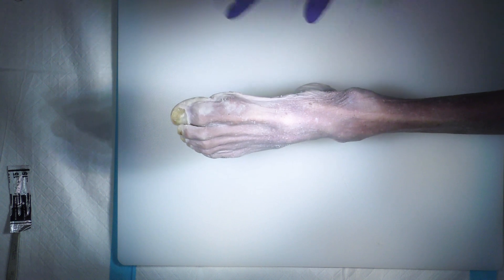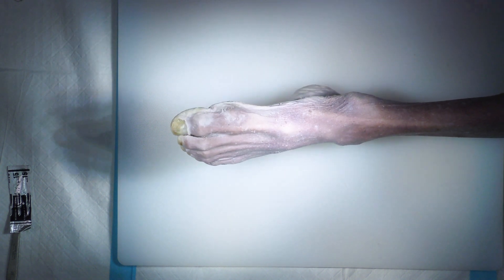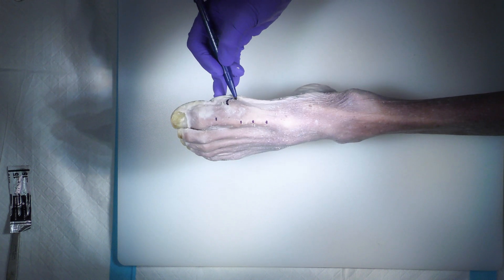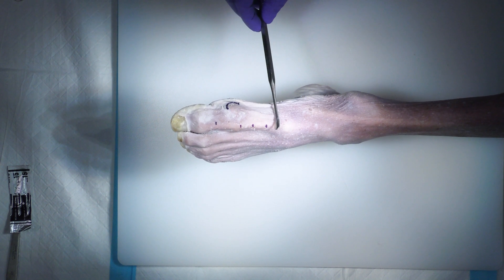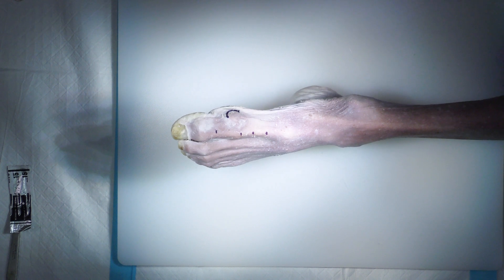First I'd like to be on the medial side of the patient, obviously identifying my landmarks. Here's the EHL tendon, here's the medial eminence, and then under fluoro I usually like to find my starting point for my wire, then my incision and osteotomy site.